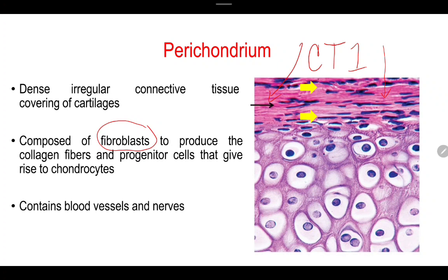Okay, fibroblasts. Your fibroblasts, they produce collagen fibers in health. Nagtutulungan to sila guys, ng chondrocyte. Chondrocyte mo nag-produce gyapon siya og kanang mga fibers and ground substances. So, saan makita ang fibroblast? Sa perichondrium. Saan makita ang ating chondrocyte, sa baba ng perichondrium. Okay? Yan, this is an example of a chondrocyte. Okay? Itong layer dito yan, itong mga small elliptical shaped cells, these are all chondroblasts. Okay? So, kung makita ninyo, ito yung ating perichondrium. Sa baba ng perichondrium is the chondroblast.